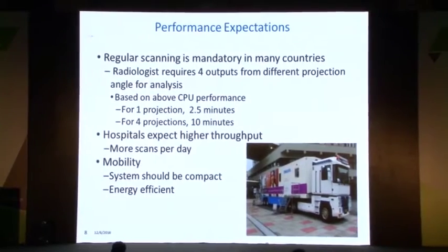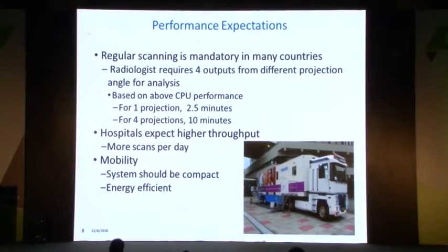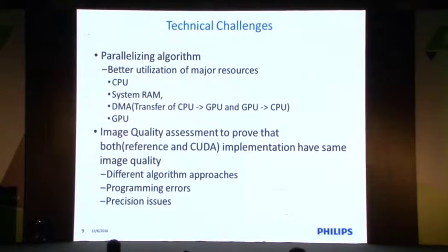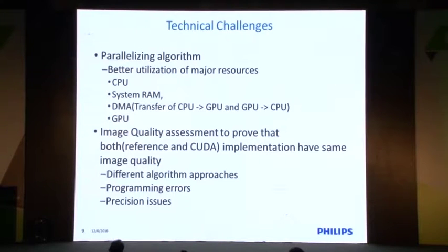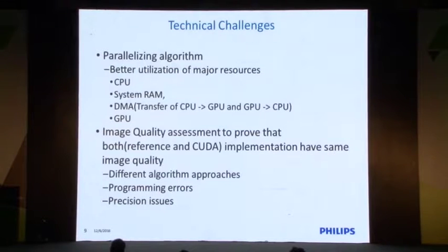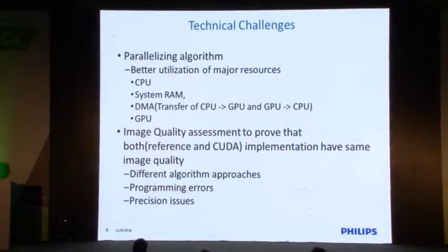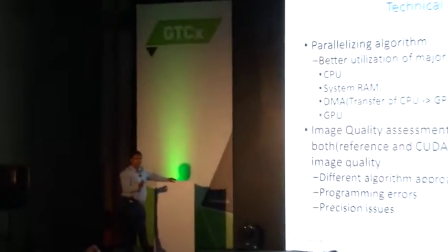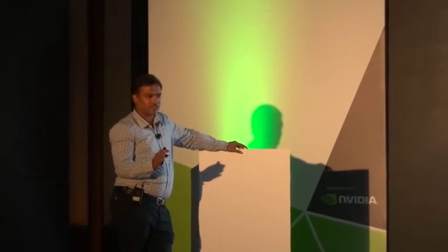The challenges we faced included how to optimize across four resources: CPU, system RAM, CPU-to-GPU transfer, and GPU resources. Another major challenge was image quality assessment — since we were porting to different hardware and medical law is very strict, we had to document everything and prove that whatever quality we got on CPU, we got exactly the same on GPU.